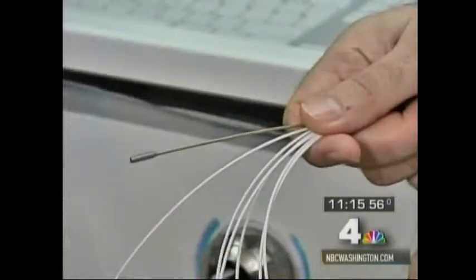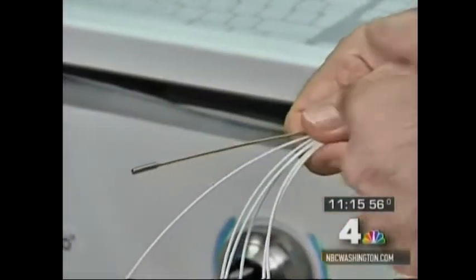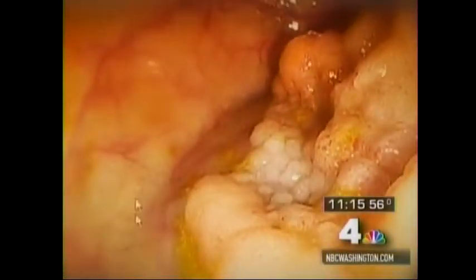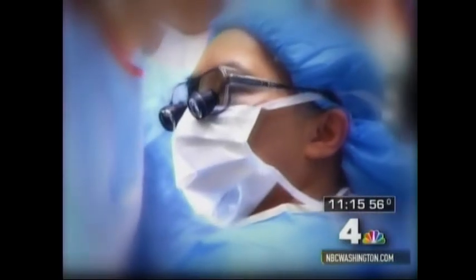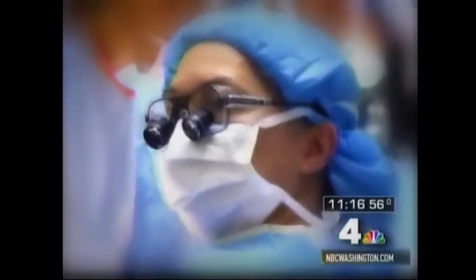It's a flexible microscope inserted into the body during routine procedures like colonoscopies. The scope can magnify tissue up to 1,000 times, allowing physicians to instantly detect whether there are any cancerous or precancerous cells. So here we can decide immediately if we need to do something, sample more, treat more, take it out. That can save patients from unnecessary procedures and the stress of waiting for test results.